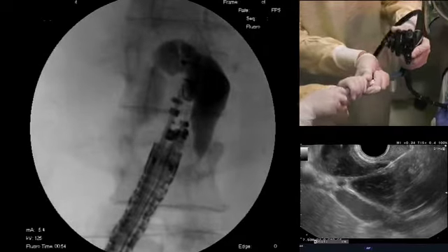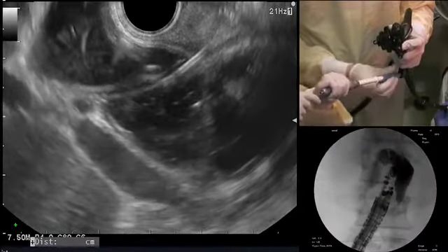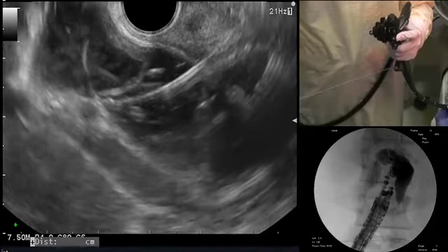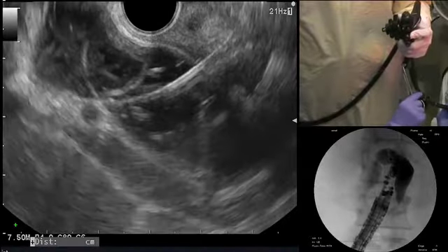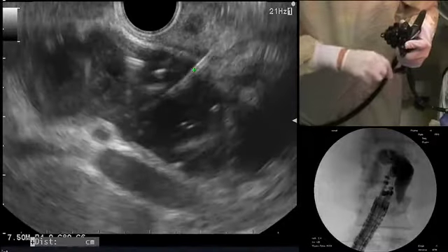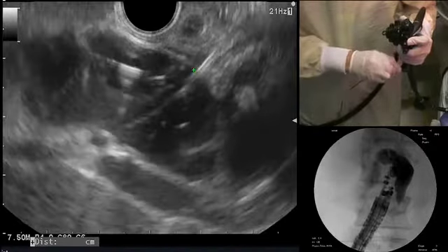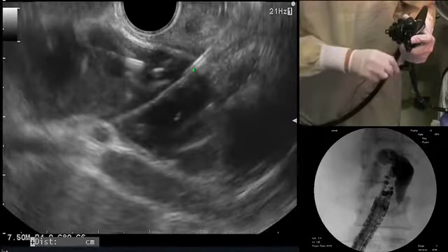Now we're ready to do an exchange. I'm going to lock this thumb screw back up and remove the FNA needle. Our next step will be to take our cystitome and advance it over the wire. I'm now advancing the cystitome over the wire, with my elevator closed so that I can feel when the cystitome hits the end. The nurse is giving traction on the wire, allowing me to advance.